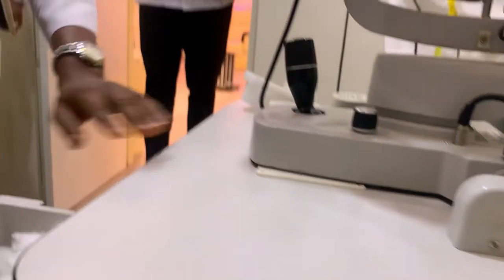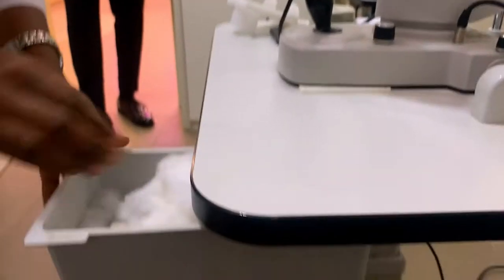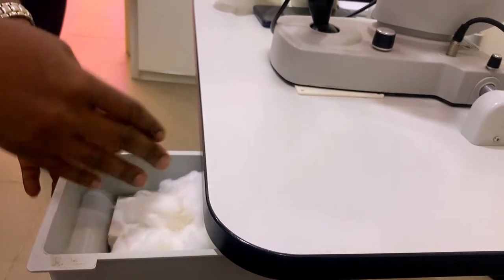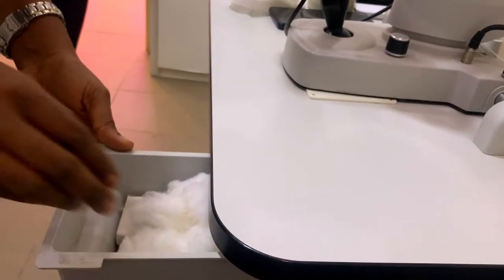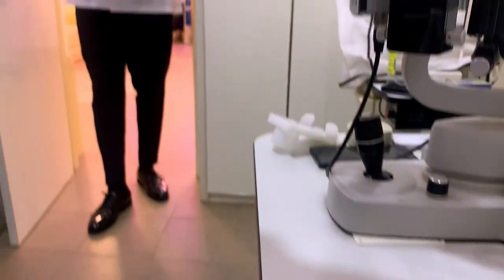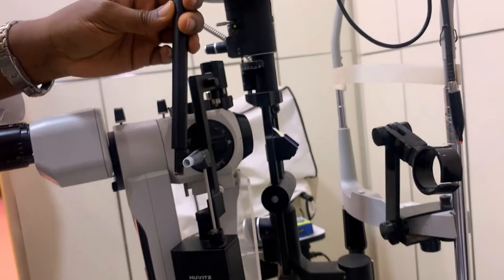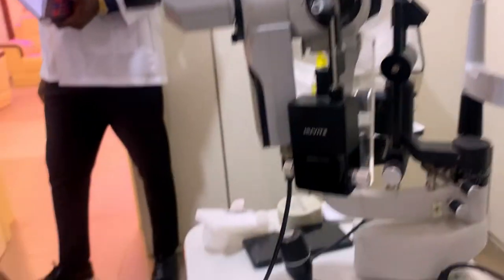Outside of that, the next thing is the accessory drawer. This accessory drawer is where you can keep cotton wool, extra bulb, extra diffuser, your focusing rod — which you can use to demonstrate some techniques when teaching — your fluorescein strip, your Schirmer strip, and so on. It's just for your accessories.